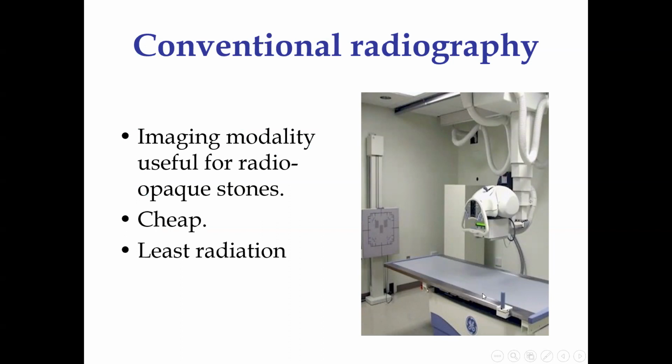Now you have these, like in the digital cameras, you don't have those films developing, but the same information that you get on X-rays. Remember, the radiation dose is the least in cases of X-rays. Why do we still use X-rays? Why not just give up X-rays?